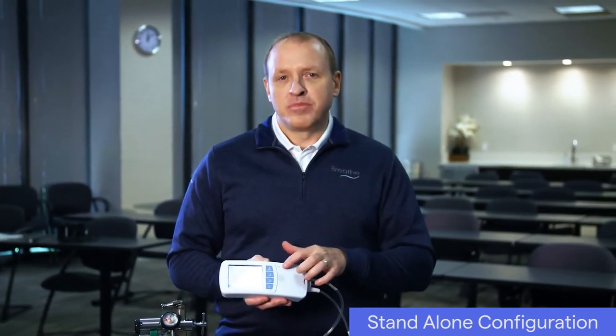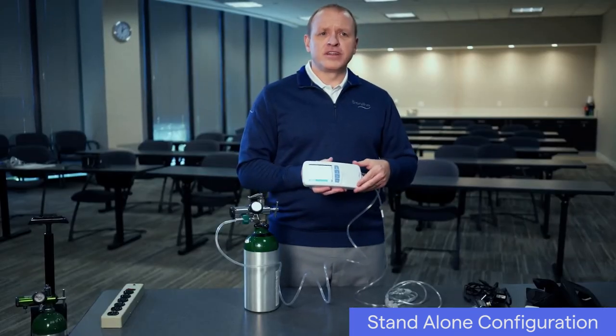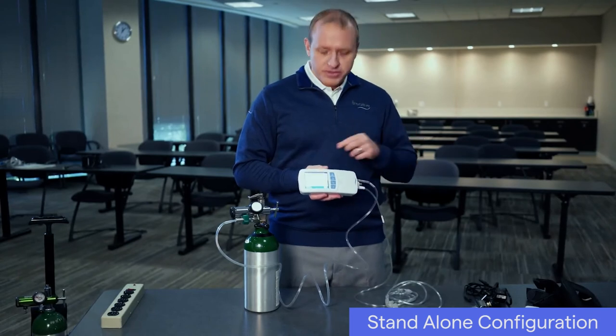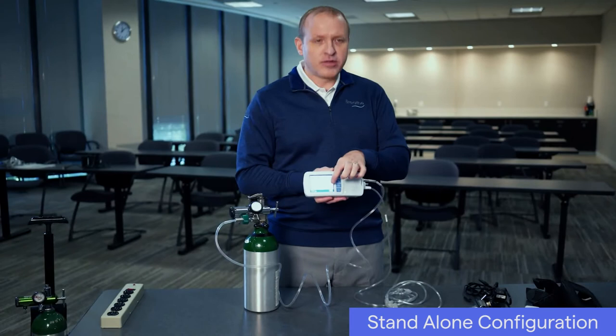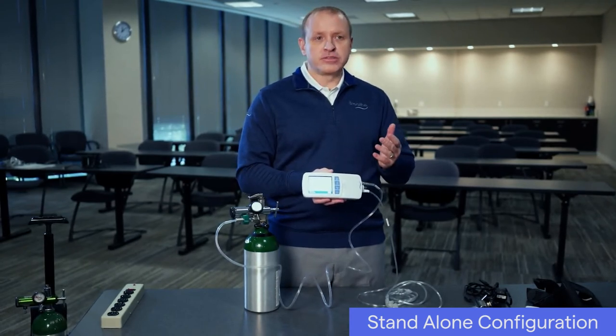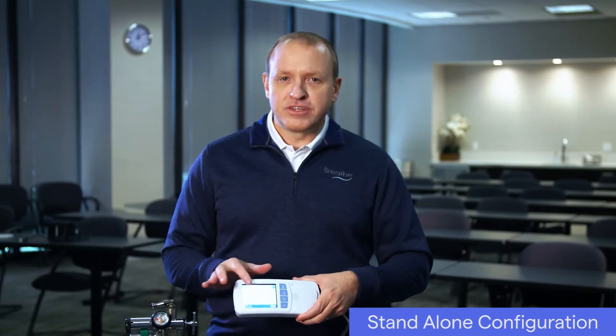Press an activity button to begin ventilation. The Life 2000 ventilator has four hours of battery life. When the ventilator is powered on, you can check the battery level at the bottom right corner of the screen. Refer to the instructions for use for more information. If not connected to AC power, make sure the ventilator has sufficient charge for your length of use.